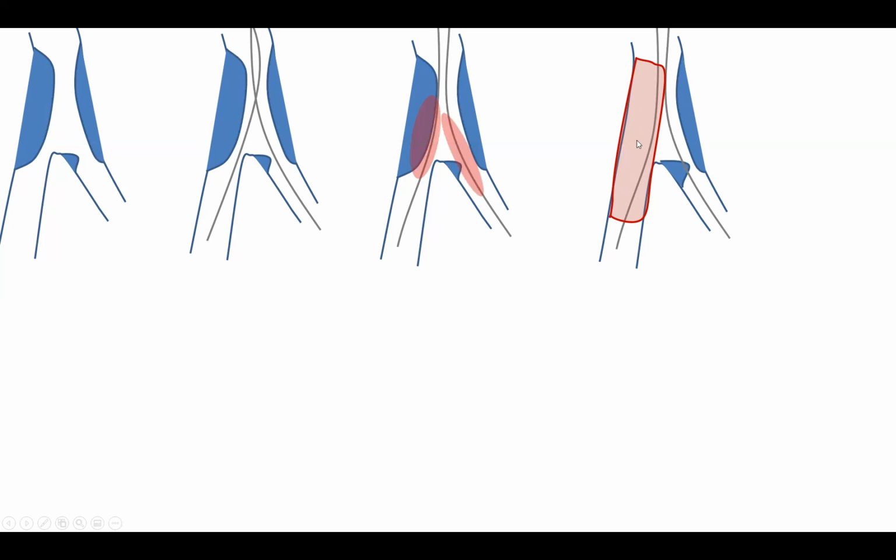Now, regarding the main branch stenting, it's very important, as I alluded to earlier, to stent based on the distal vessel, okay? One, as I explained, if you stent based on the proximal vessel, you will push that distal main branch and create carina shift and narrowing of that side branch. Two, of course, you can create dissection and perforation if you oversize distally. So when you stent the main branch, you're jailing that wire, which is okay.